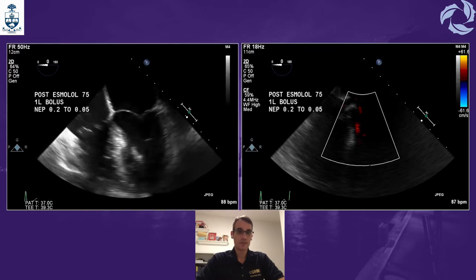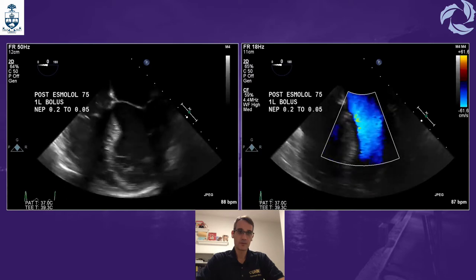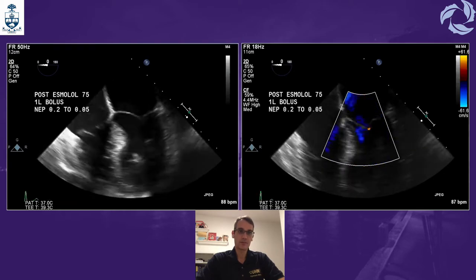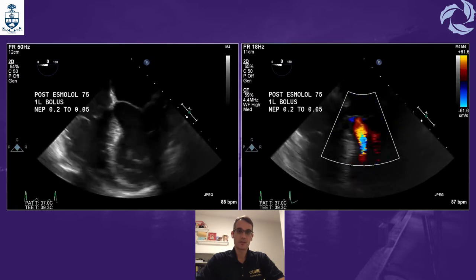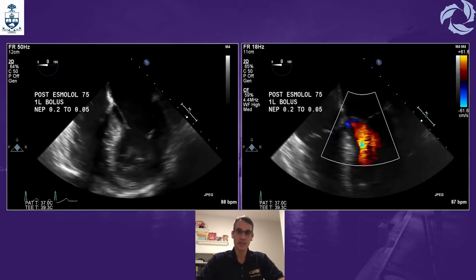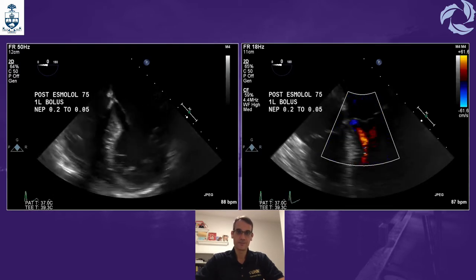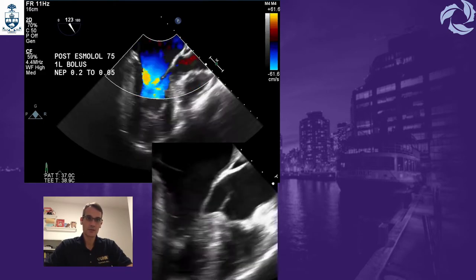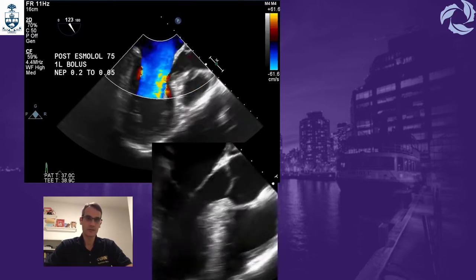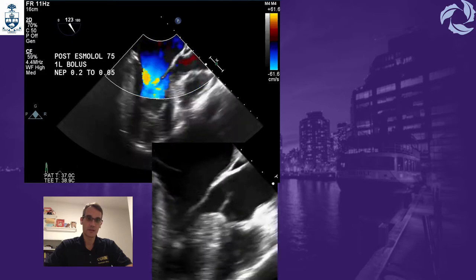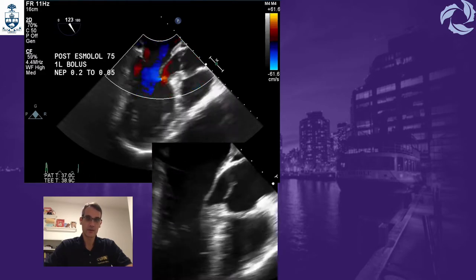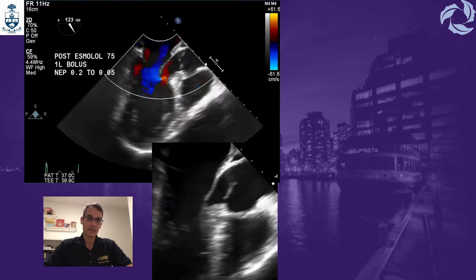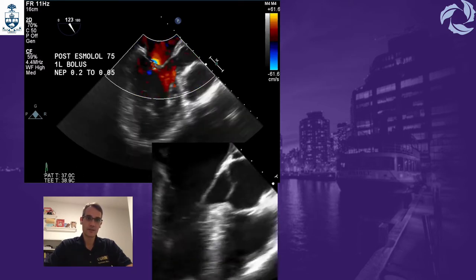Going back to the mid-esophageal view, we have the four-chamber view on the left side where you can see how both ventricles now fill and how they are contracting well, but not in a hyperdynamic manner. With color applied, there is not much flow acceleration to the LVOT and we cannot see any mitral regurgitation. In the long axis view, the aortic valve is ideal to assess for LVOT acceleration, and you can see there is minimal mitral regurgitation and little flow acceleration — and the anterior mitral leaflet is not being sucked into the LVOT.